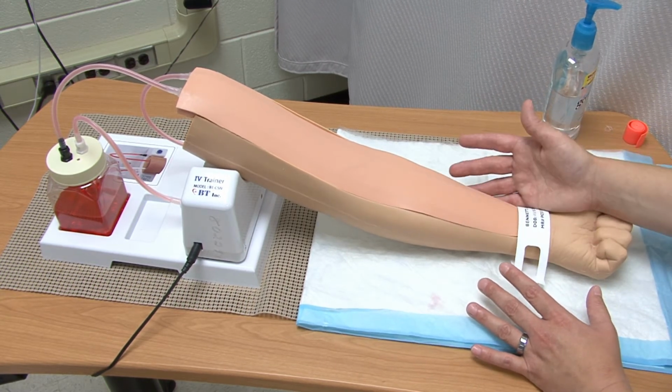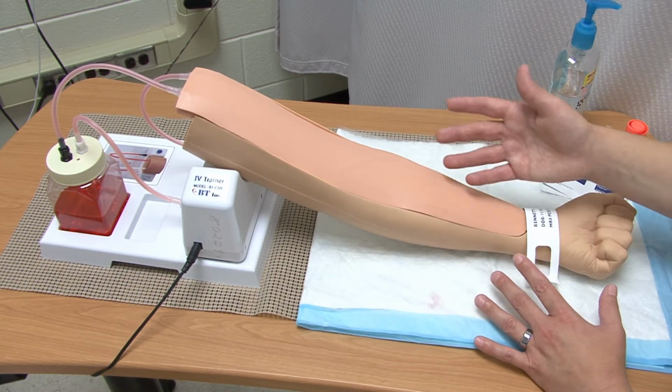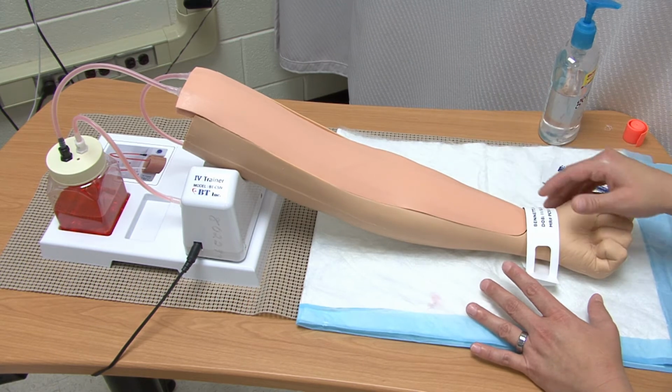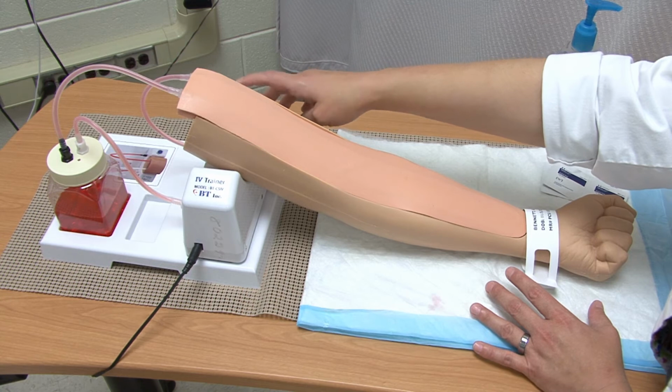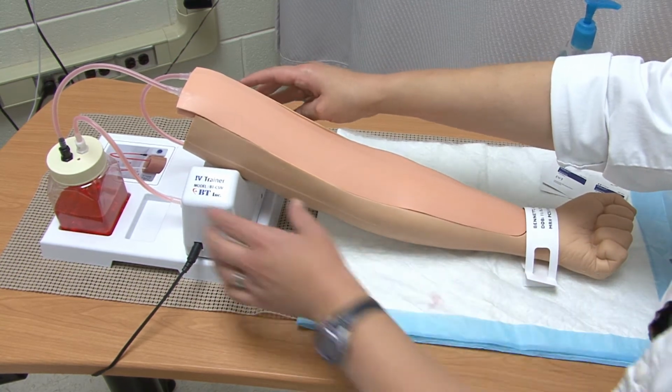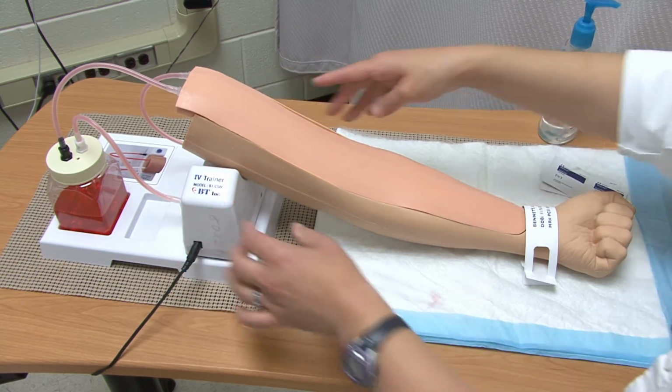I have moved over to the IV task trainer now, and you'll note this is what you guys will be doing your practice on for the most part. I'm going to go ahead and circulate the fluid through again and make sure that it's ready.